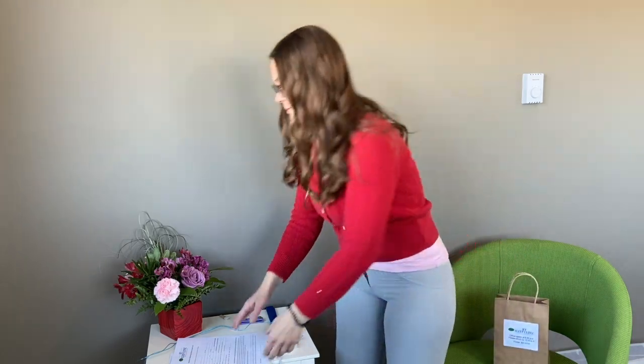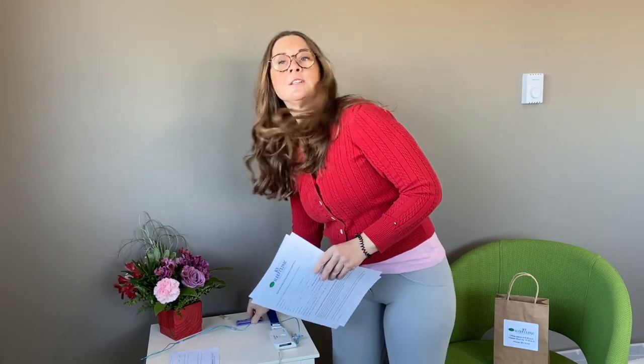When you get home with your package, inside you're going to find a few things. You're going to find some paperwork to complete — your registration form and a medical information form. On the medical information form you'll need to measure around your neck, so we have also included a measuring tape.